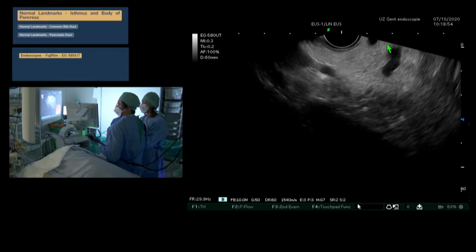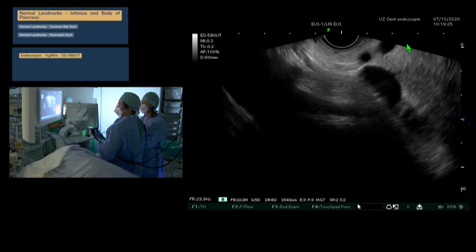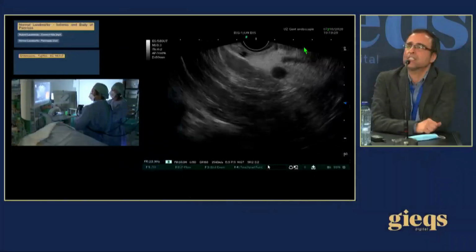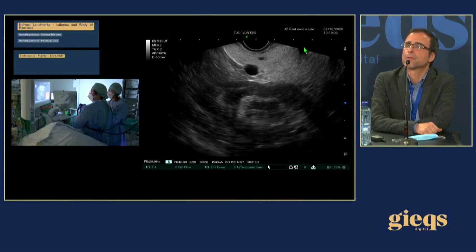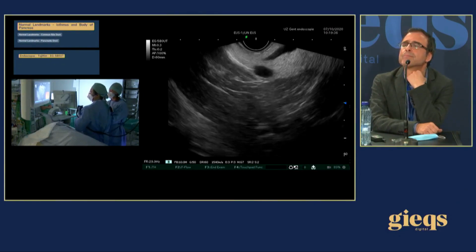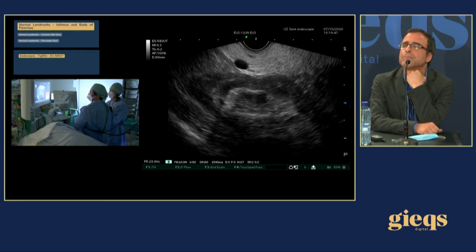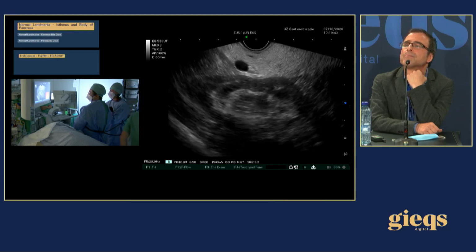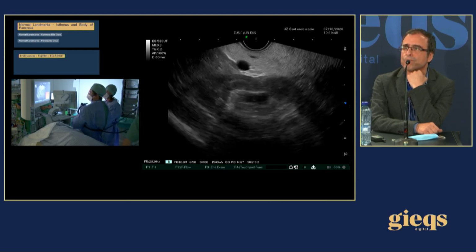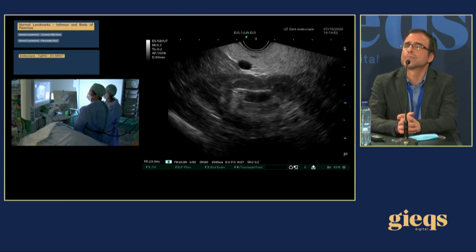Can I have a question? Yes, Arjan, sure. When you look at the parenchyma of the pancreas, do you use the Rosemont criteria, the classification? Yes, absolutely. So we will be looking at changes in the pancreas parenchyma, be it enhanced echogenicity, ductal changes, dilation of the duct, or stones, or hyperechogenicity of the duct, to be able to already suspect the presence of underlying chronic pancreatitis.